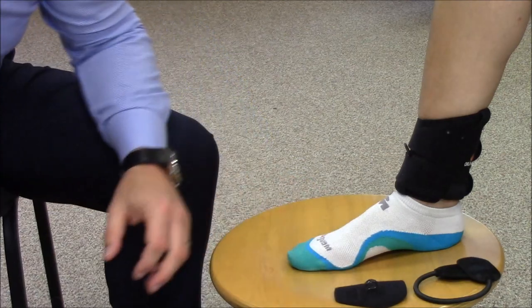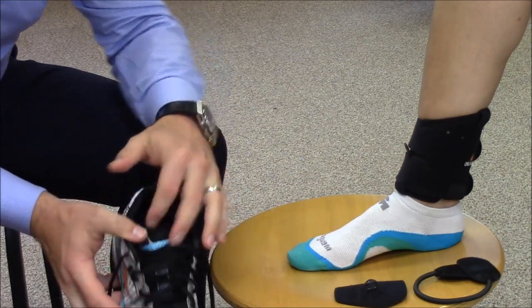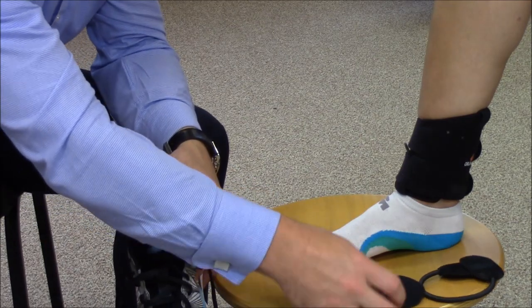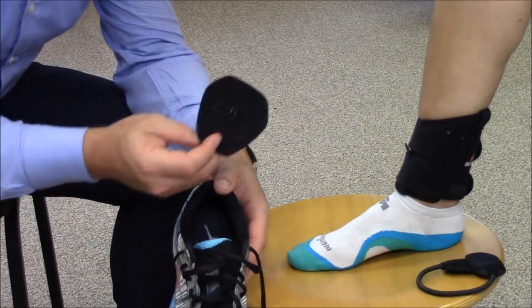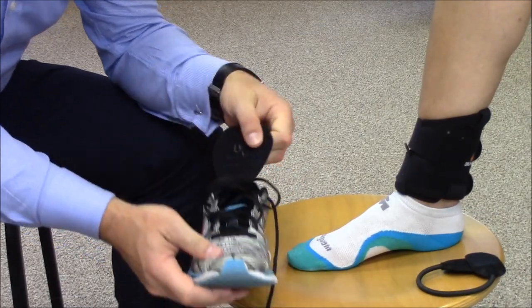Place the tongue and hook attachment midway at the forefoot, situated between the tongue and lace of the footwear. The lace should be fastened securely in order to prevent the tongue and hook attachment from migrating.